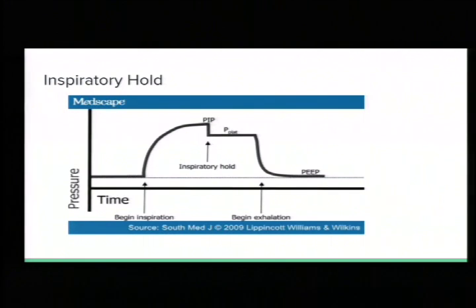There's a setting on there, the inspiratory hold, so they take in a deep breath and you hold that on the vent. That gives you your plateau pressure. So I don't care what this peak inspiratory pressure is up here. That really means nothing. This plateau pressure is what's really looking at the pressure on the alveoli themselves. Not this kind of peak up, but where are they at with an inspiratory hold? How much pressure are those alveoli getting exerted on them?